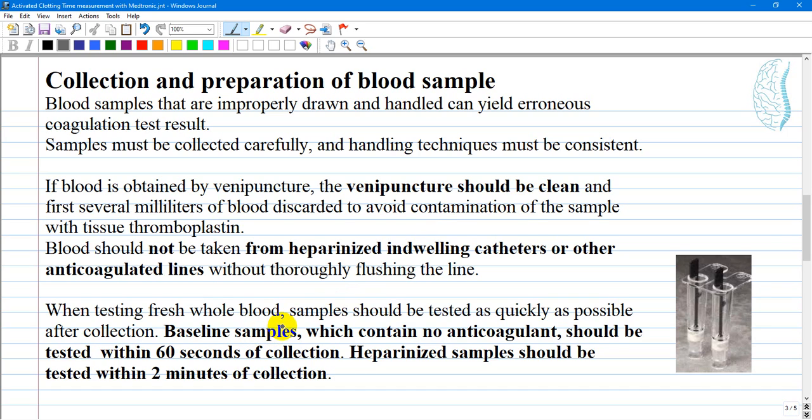When testing fresh whole blood, samples should be tested as quickly as possible after collection. Baseline samples, which contain no anticoagulant, should be tested within 60 seconds of collection. Heparinized samples should be tested within 2 minutes of collection.